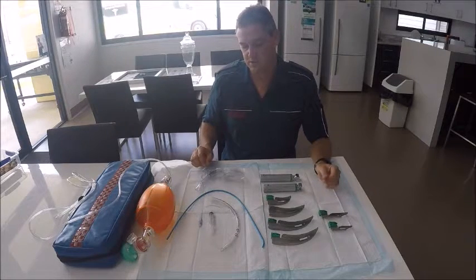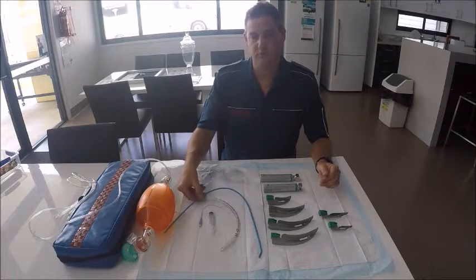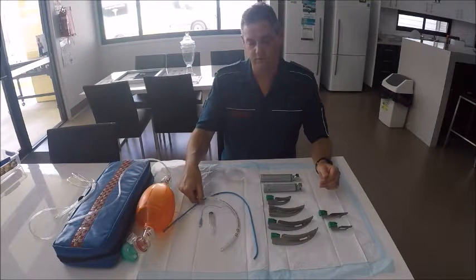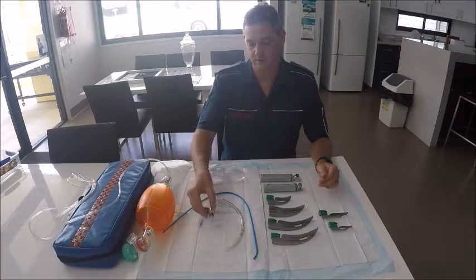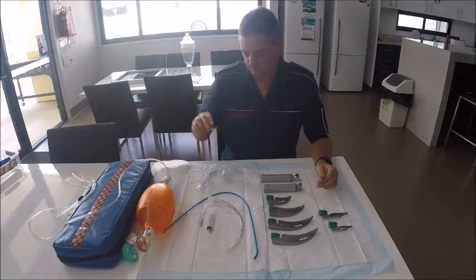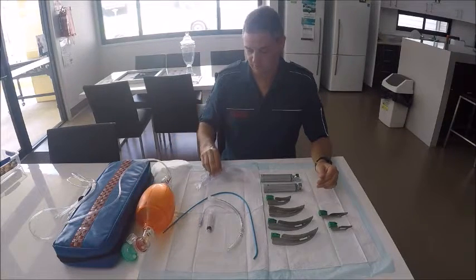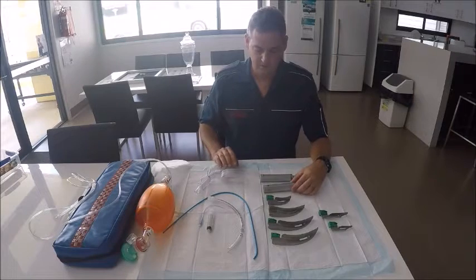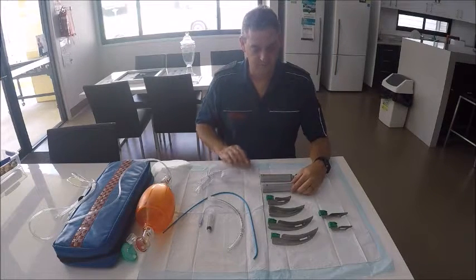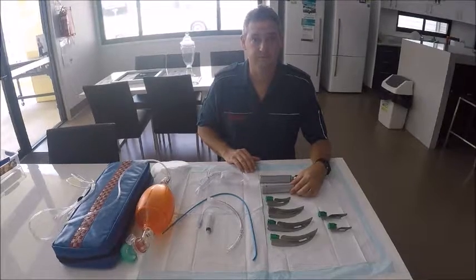So this will be a preparation set up for an intubation according to QAS protocols. We have a bougie, all intubations through the QAS are done by bougie. We've got our ET tube, we've got a 10mL syringe ready to inflate the cuff. We've got a bag valve mask, we have suction ready and available. We've also got a rescue airway in case of a failed intubation, which in this case would be our LMA Supreme. So I'll now give you a practical demonstration of the process of laryngoscopy.